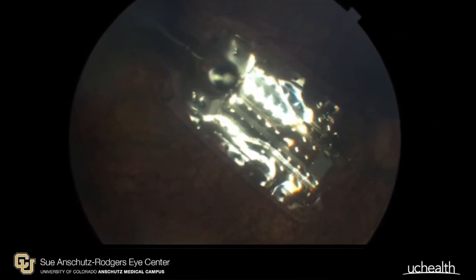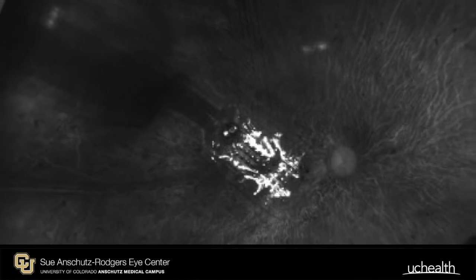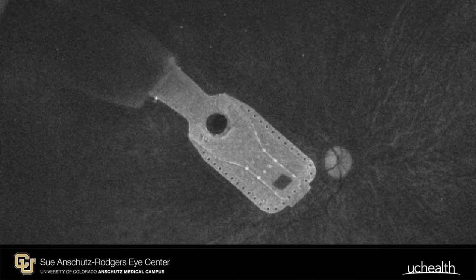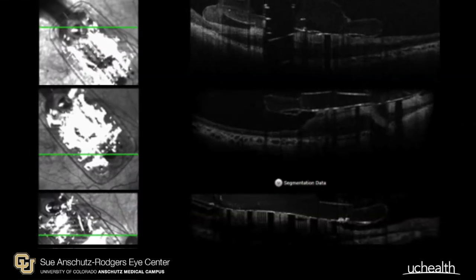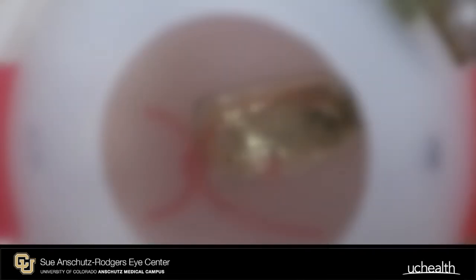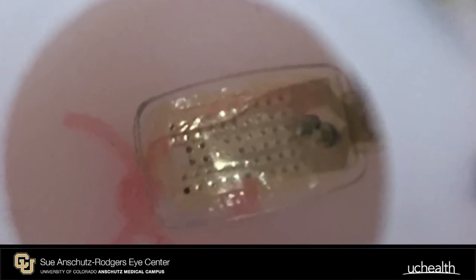Postoperatively, the electrode array is inspected to assure that it is oriented correctly in a diagonal fashion across the macula. Multiple imaging modalities can be utilized to assure good apposition of the electrode array with the inner retinal surface. Postoperative healing proceeds for one month prior to programming the device and turning it on.